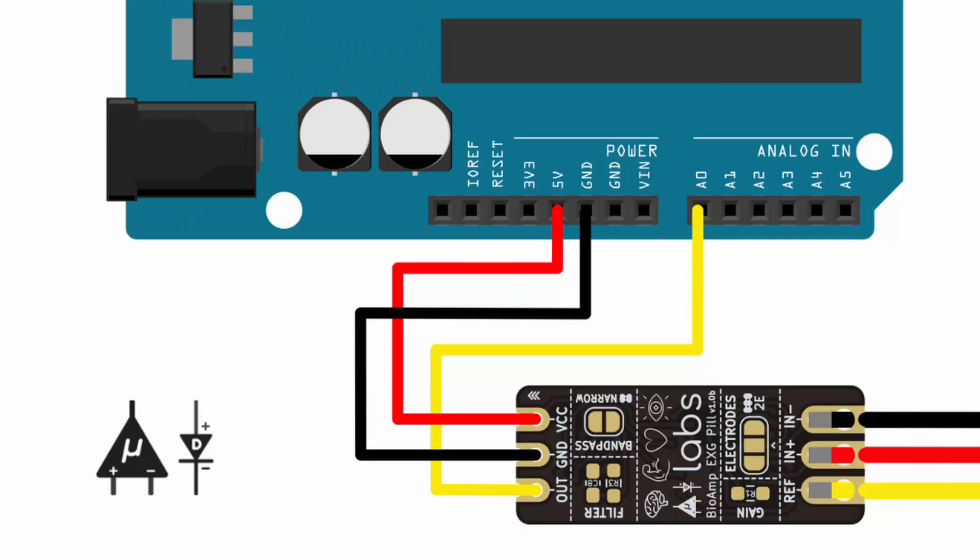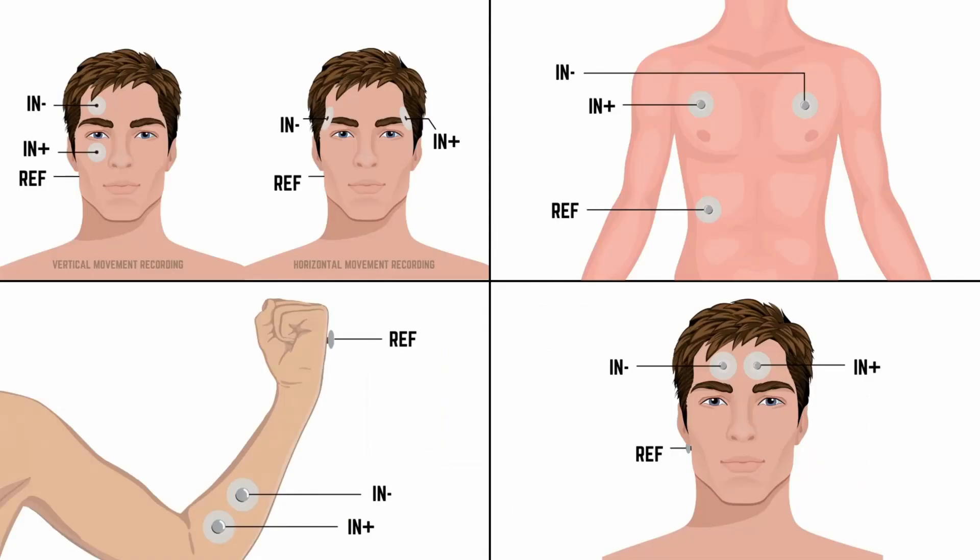Based on that, for these sensors we need to use analog pins. I'm going to show the connections with the BioAmpEXG pill, but it's almost the same with the other ones too. For power, connect VCC to 5V on the Arduino and GND to GND on the Arduino. The output goes to one of the analog pins — A0 is often used. Then, based on what you want to detect, you place the electrodes according to these pictures.